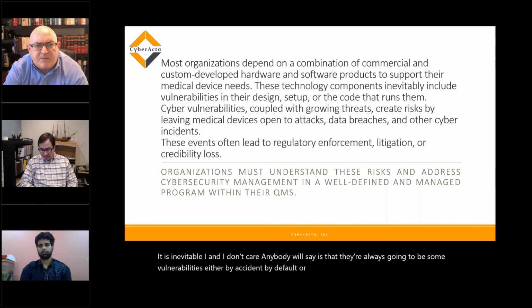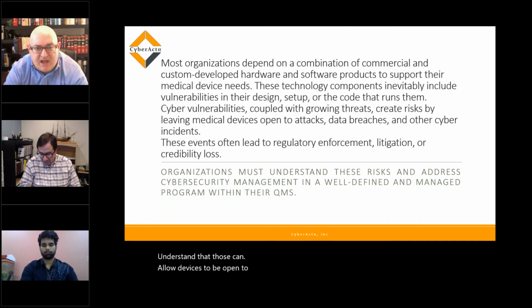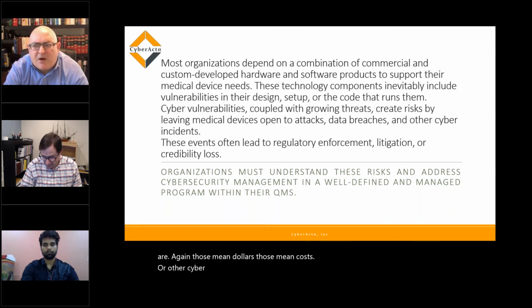Really, it's on us to understand that those can allow devices to be open to attacks, data breaches, under HIPAA or GDPR. Again, those mean dollars, those mean cost, or other cyber incidents. About a month ago, there was what the media alluded to as the first known death directly attributed to a cyber incident.